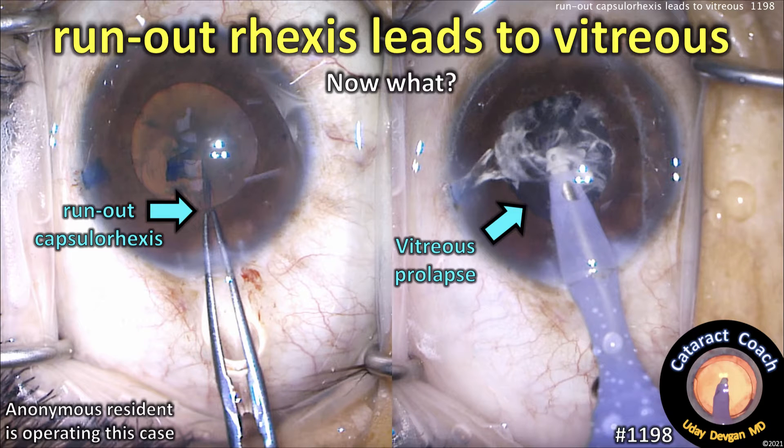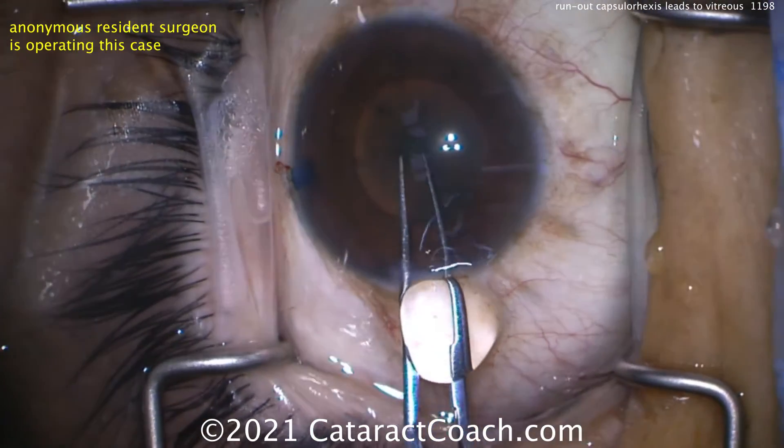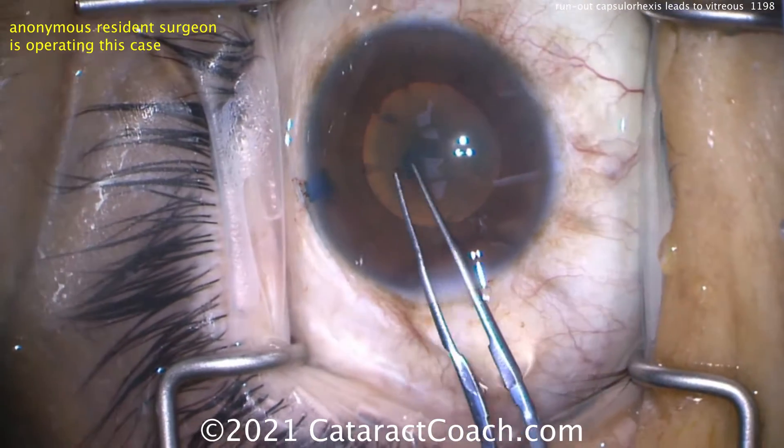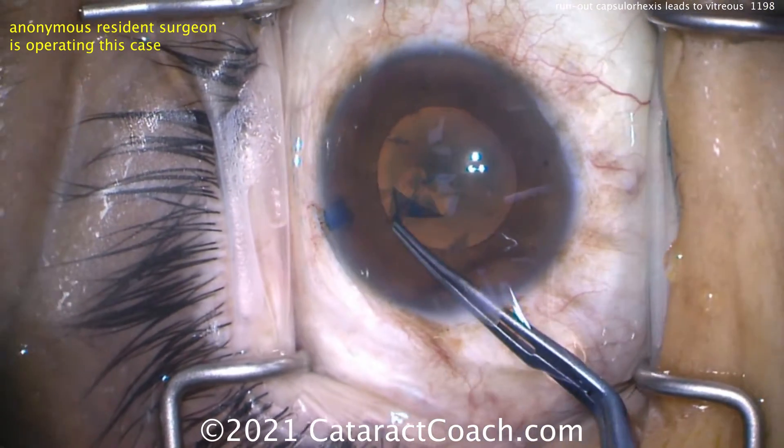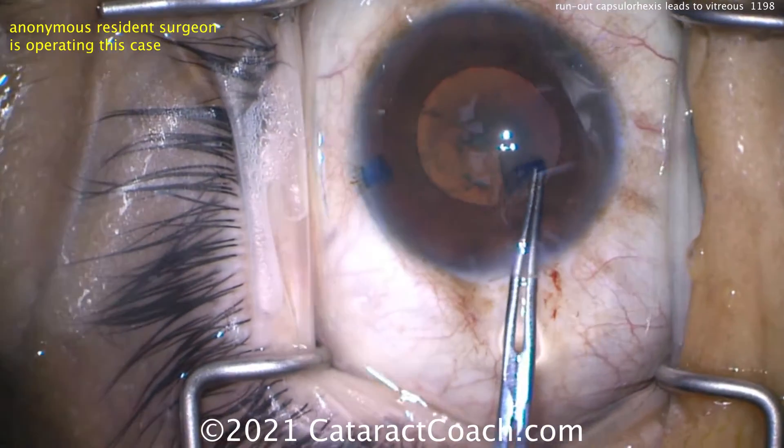cataractcoach.com. A run-out capsulorhexis leads to vitreous loss — now what do you do? This is a case performed by a resident. We've sped it up so we can get through it. Trypan blue dye was used, with a slightly smaller pupil — not terrible — and then starting with the capsulorhexis. But look what happens: you let go in that danger zone.